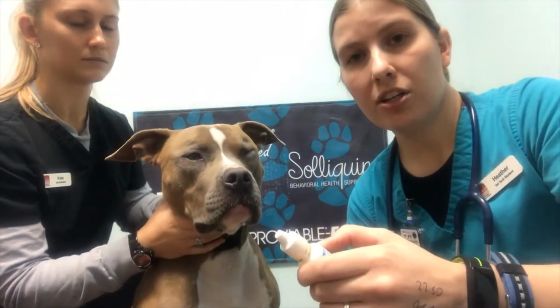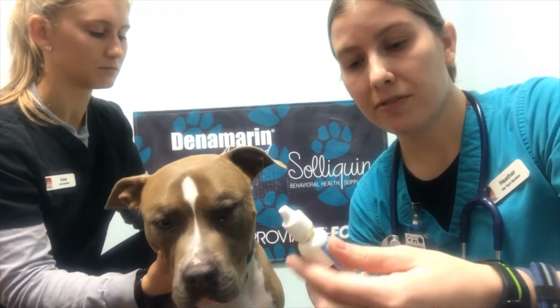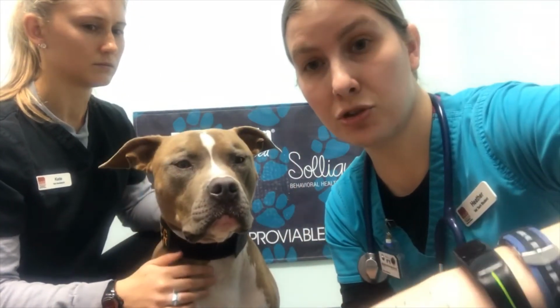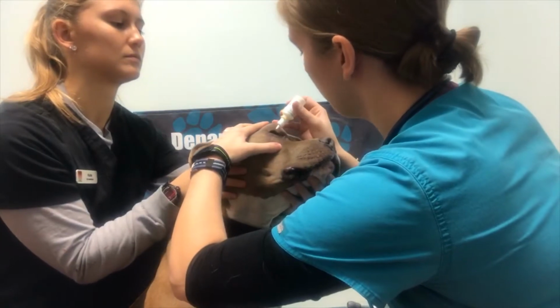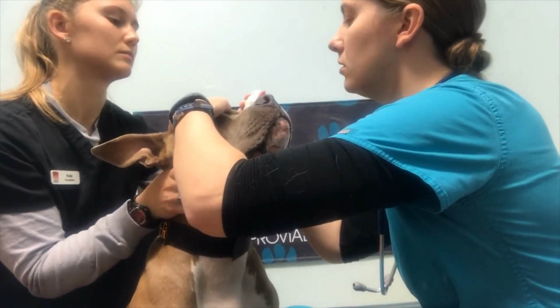So now on Dozer here, we're going to take tonometer readings using our TonoPen. First off, I'm going to put some tetracaine in each of his eyes and let it sit for a minute or so while I'm calibrating the TonoPen. This just helps numb the eye. That way, as I'm putting pressure on the eye with the TonoPen, it doesn't cause discomfort.